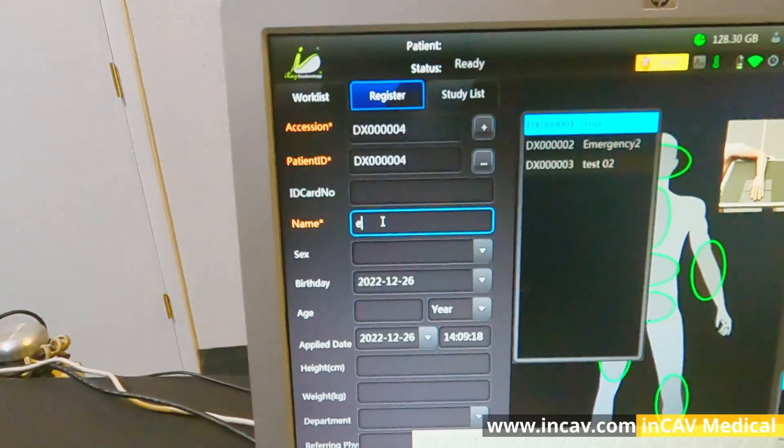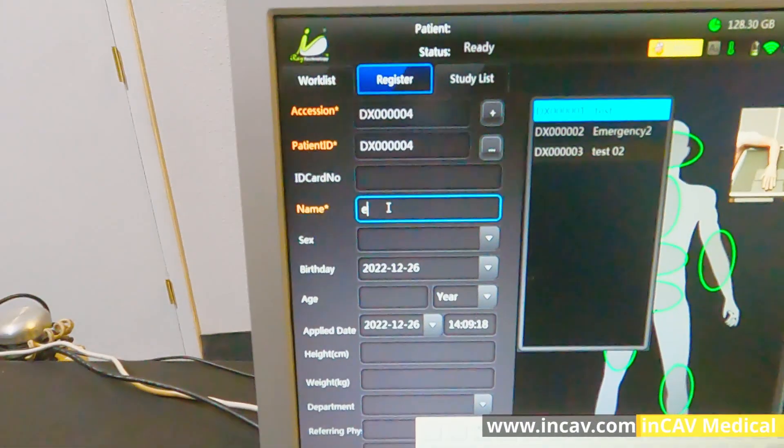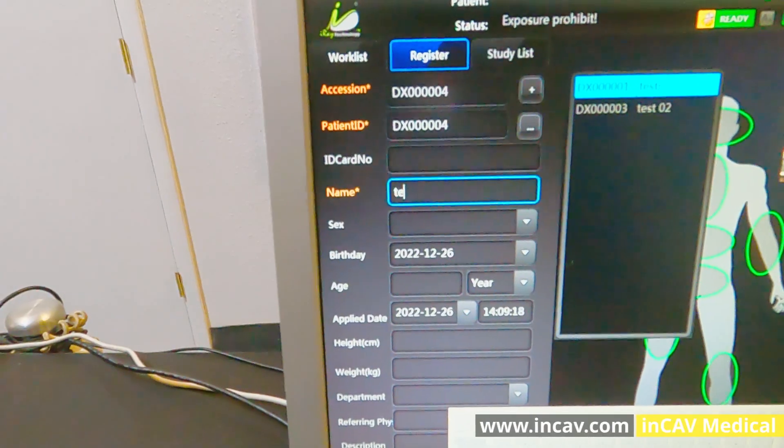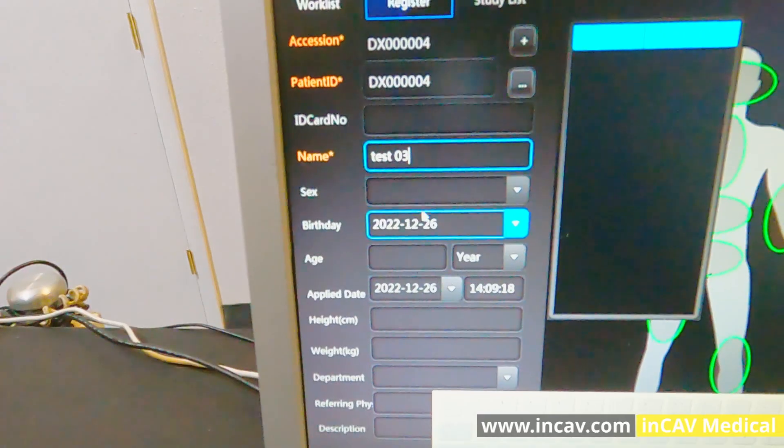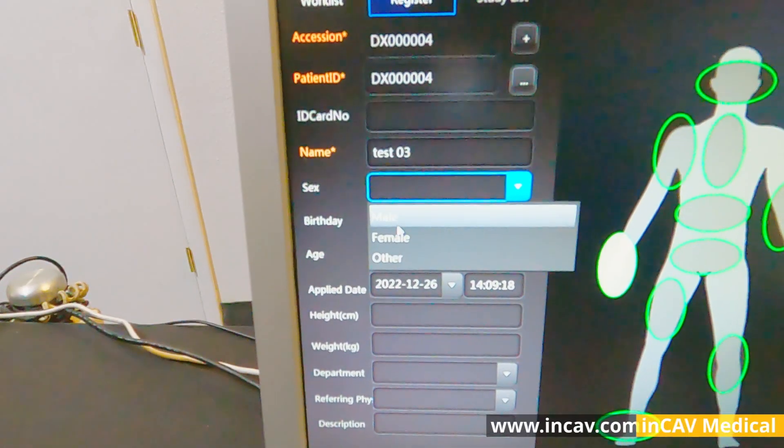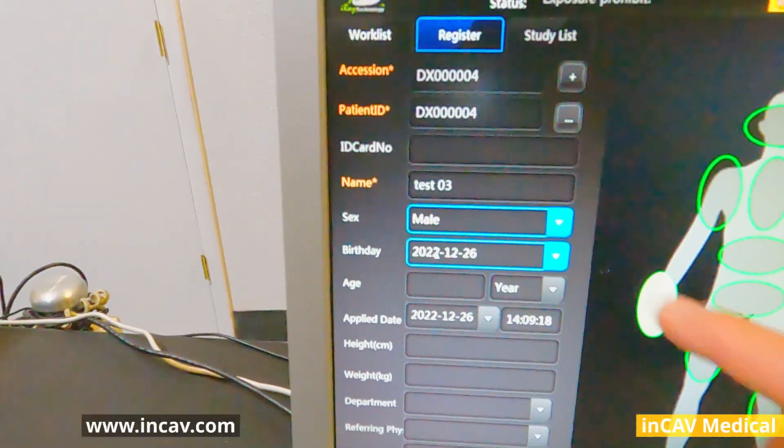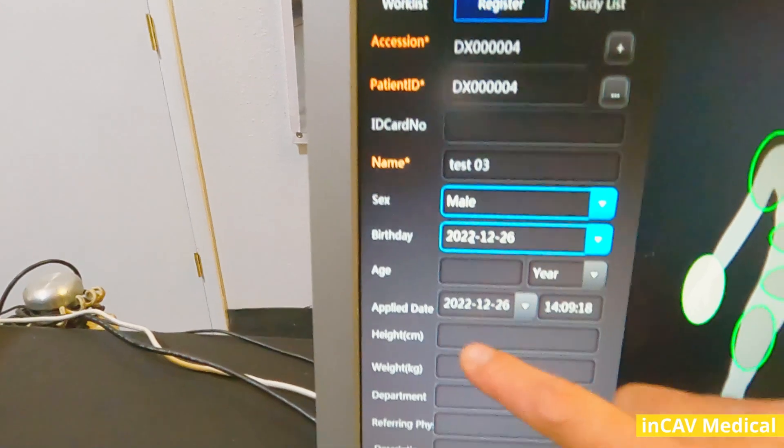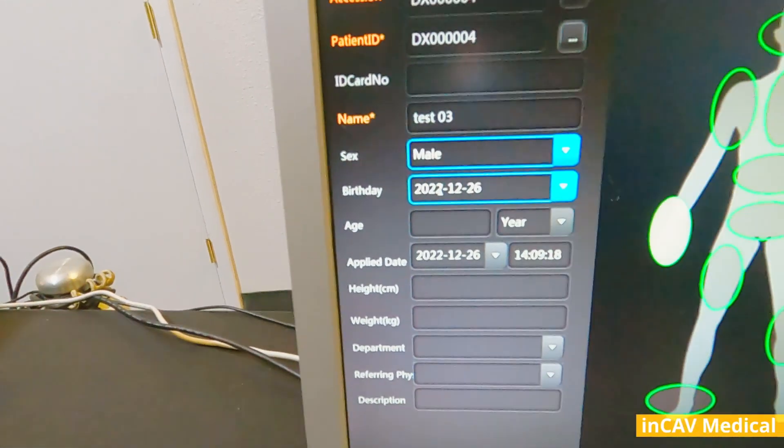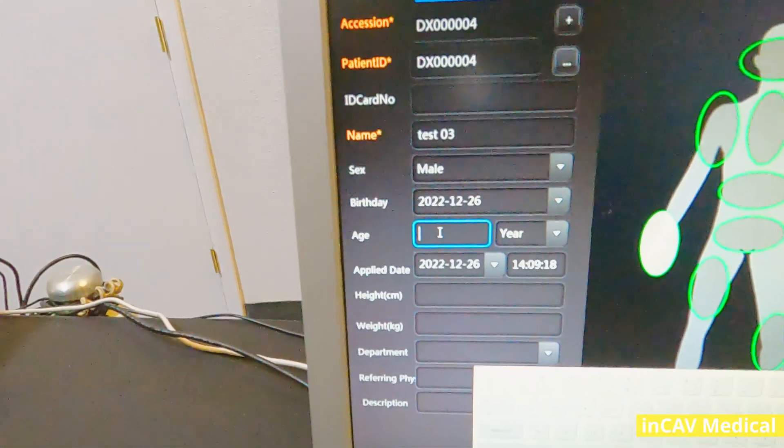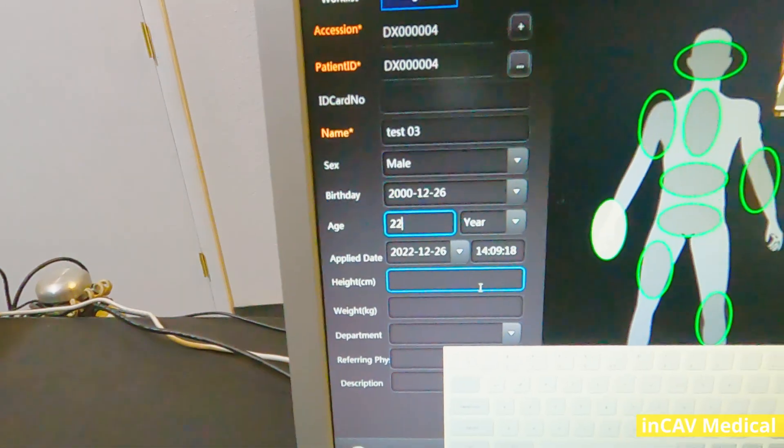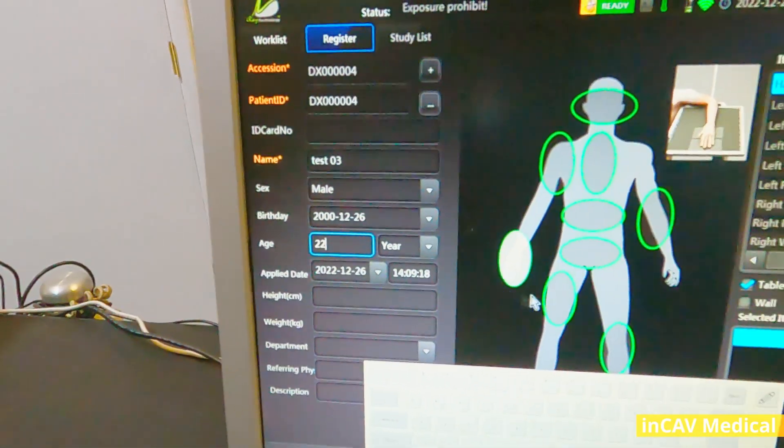Now we are going to do an x-ray to test the detector. First, we need to register the patient as a test. Notice that the red fields are required, and continue to input all the patient data that we need or want.